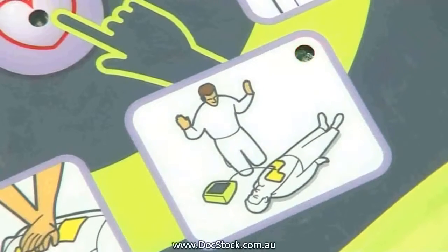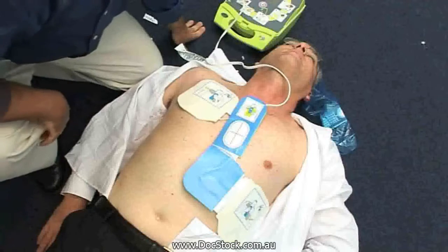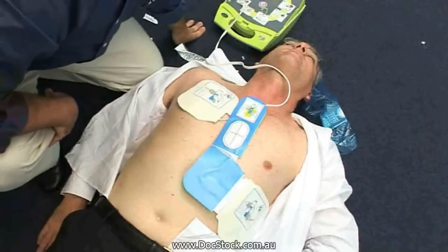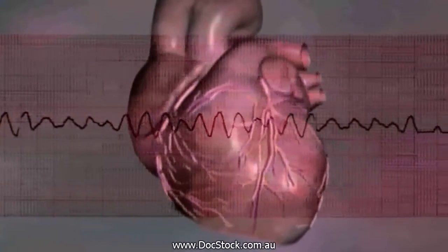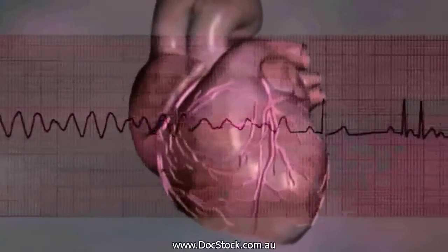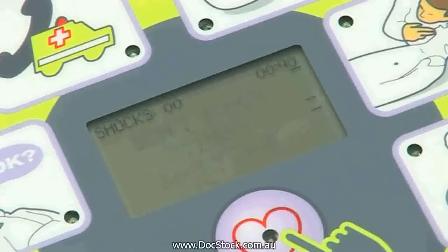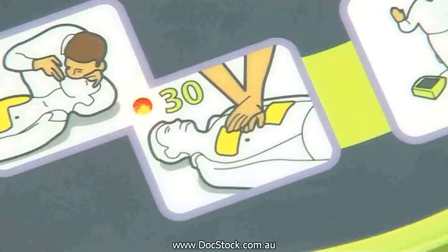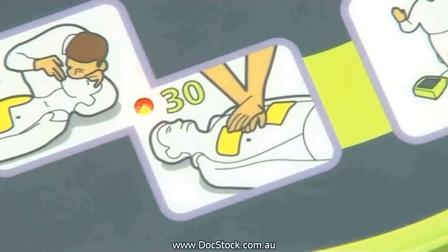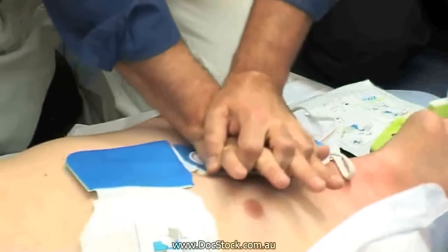The AED Plus will now assess the state of the patient's heart. A shock is required when the heart is beating irregularly and sufficient oxygenated blood is not being pumped to the vital organs such as the heart and brain. Defibrillation stuns the heart briefly, stopping this irregular rhythm in the hope that the heart's internal pacemaker will reset the heart into an effective organized rhythm. In half of all cases of sudden cardiac arrest, the first analysis advises that no shock be delivered.